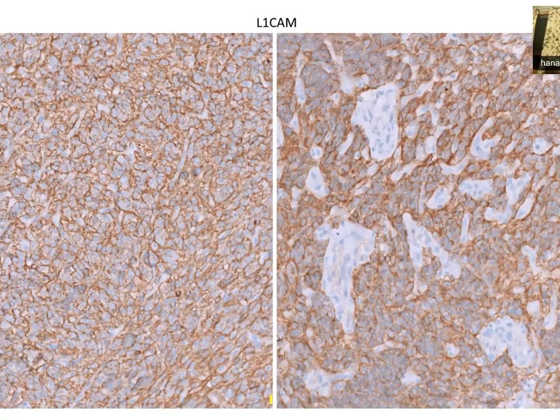Sir, L1CAM. So is it positive or negative? Positive. So you can see that the vessels are negative and the cells are all membranous. This is a cell adhesion marker. You will get membrane-like staining. Histologically, you can have clear cell morphology as a surrogate for your ZFTA.